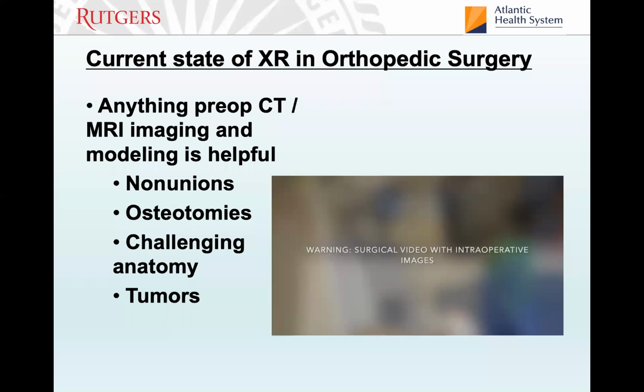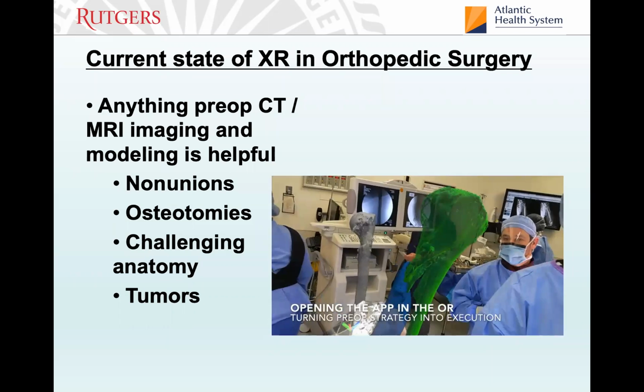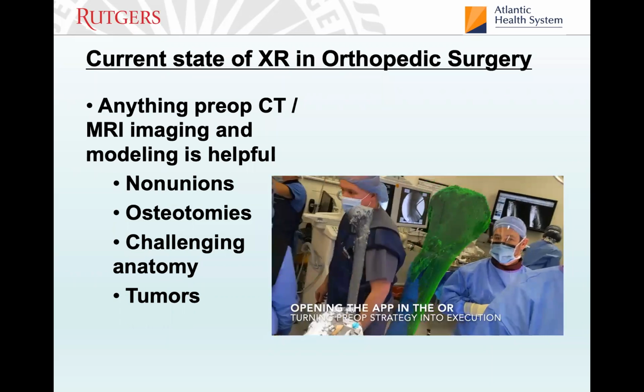So we'll go into a bit more of that in detail. But yeah, I was able to bring that to the OR, and ultimately, look, you're gonna make these decisions based on your skill set. Do you need this? No, I think it's still helpful in preoperative planning primarily, but it is nice to be able to actually make that comparison and do it in a sterile way that really has no significant risk to the patient.